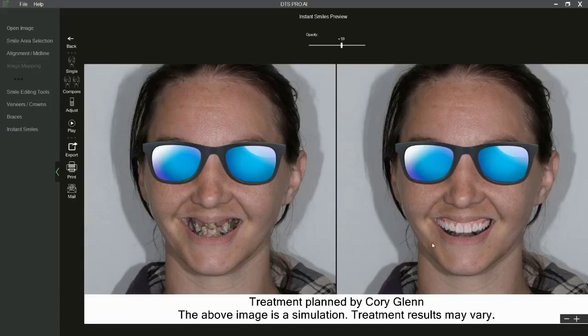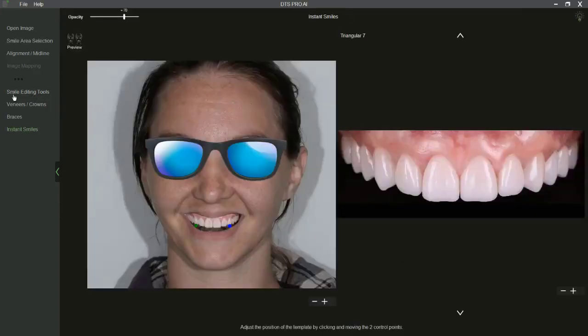That's powerful. The only thing more powerful than that is an actual digital wax up where you transfer it into their mouth, and now they're literally holding a mirror, moving around, seeing what's possible. But that obviously is much more work. I would still do this to help myself generate that wax up, right? So really, really valuable.